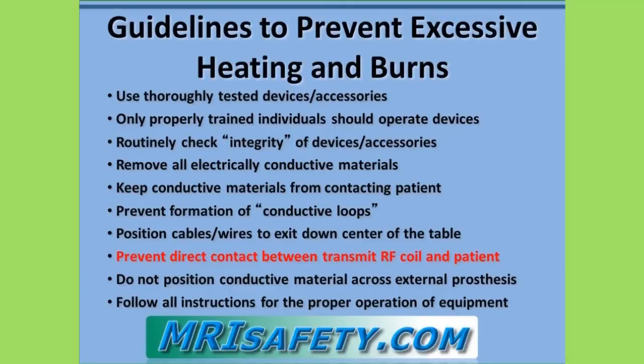The prevention of excessive heating and burns in association with the use of MRI requires an understanding of special safety criteria for patient management. The guidelines that should be implemented by all MRI facilities to prevent burns may be reviewed at the website www.mrisafety.com. Remember, it is particularly important to prevent the direct contact between the transmit RF coil and the patient's tissue. To accomplish this, you should always place insulative material between the patient and the transmit RF coil.